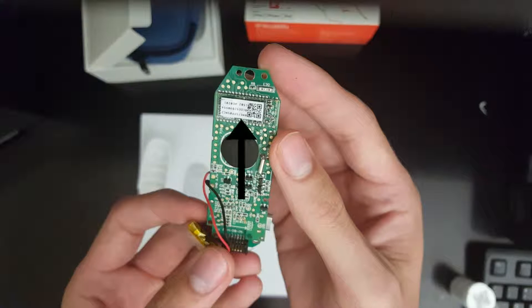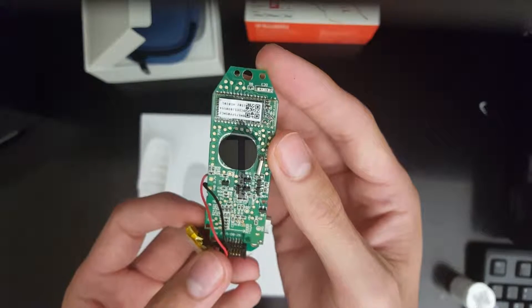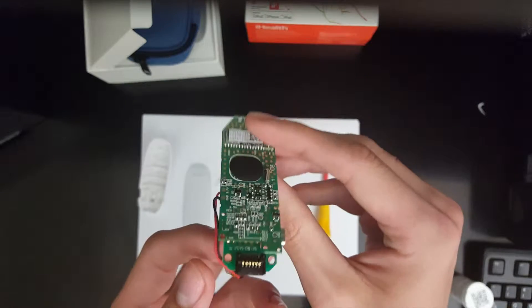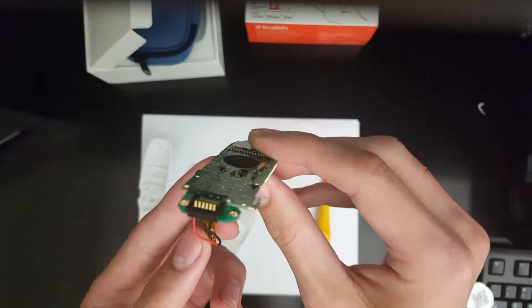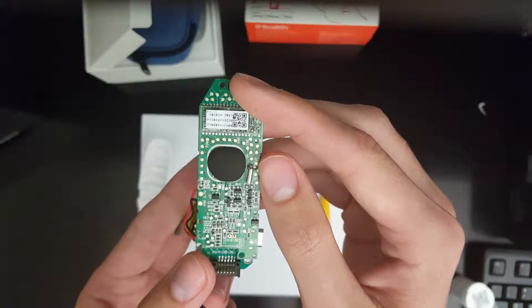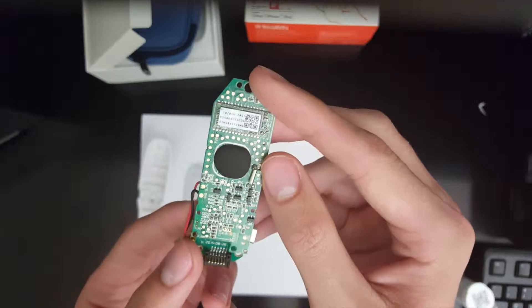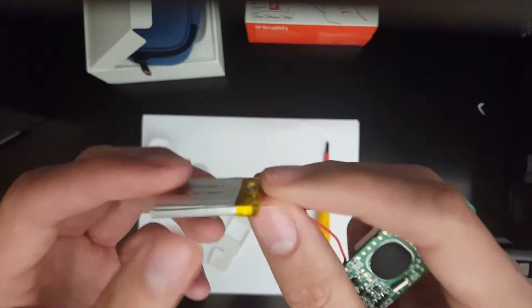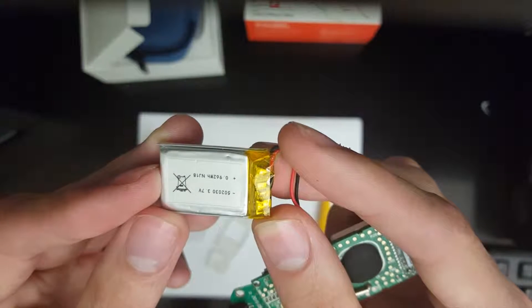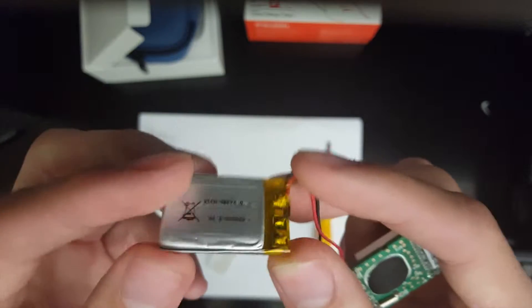Right above it is the microprocessor, which is basically the brains of the device. It integrates all of the signals and communicates with the display to make it function and display properly. At the bottom here is the 6-pin reader, which connects directly to the test strip and reads the voltage created by the strip with the blood. We also see here a lithium-ion battery, which will hold a charge for a long time and can hold up the lifetime of the device quite well. This sits at the bottom of the casing, attached to the circuit board.